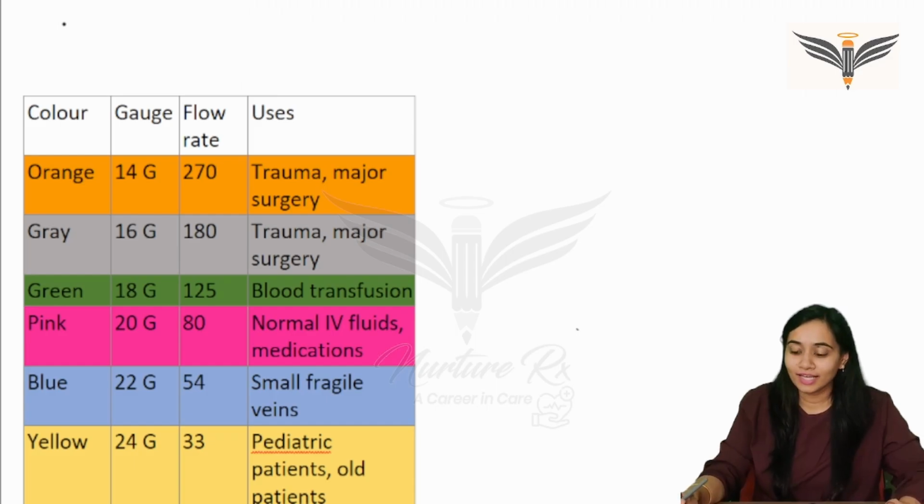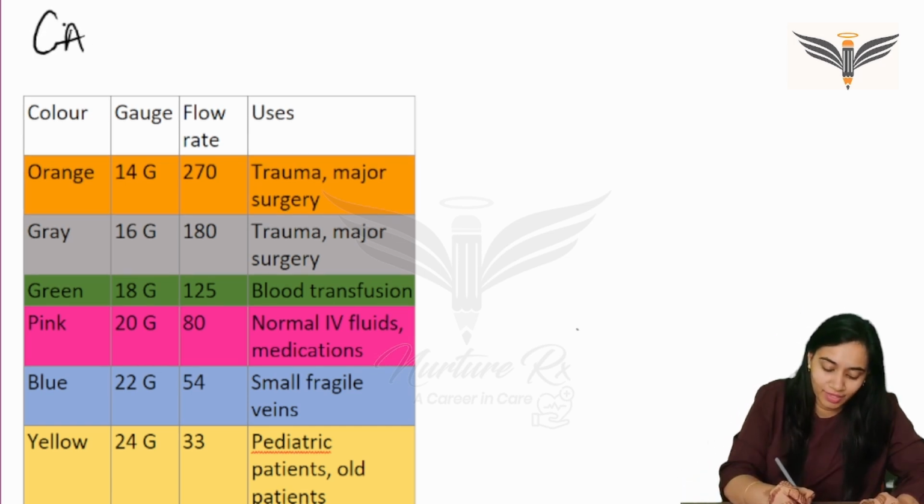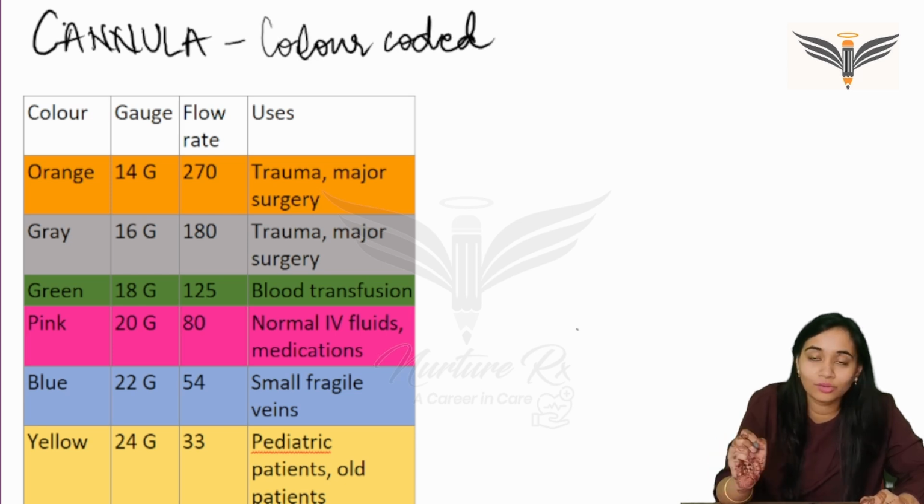Hello friends. So today our topic of discussion is cannula and its color coding. In the previous class we saw what is a cannula and what are its parts. In today's class, let's see how cannulas are color coded.